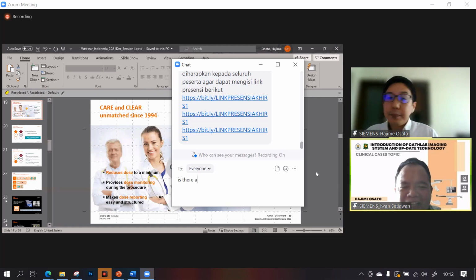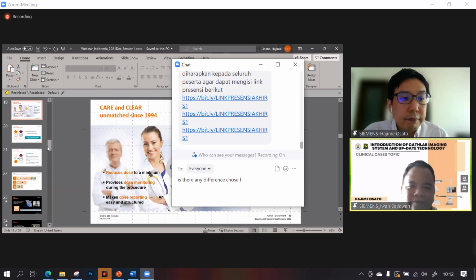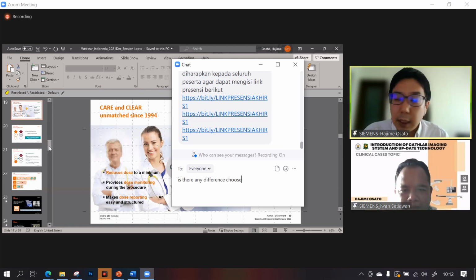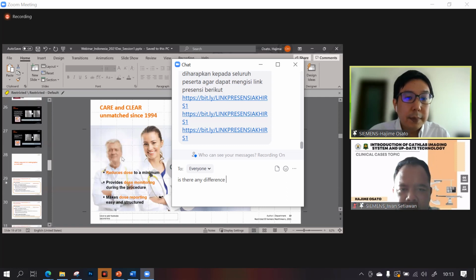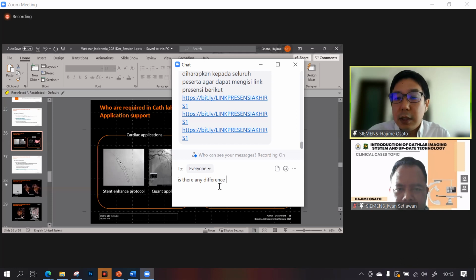I think we have a lot of questions from Bu Devi. Bu Devi is also asking: can the Artis Zee system have a multimodality approach with the others? Yes, it is possible on the Artis Zee system. But please confirm, do you have X Workplace? The applications I introduced work on our X Workplace, not on the Artis Zee system itself.